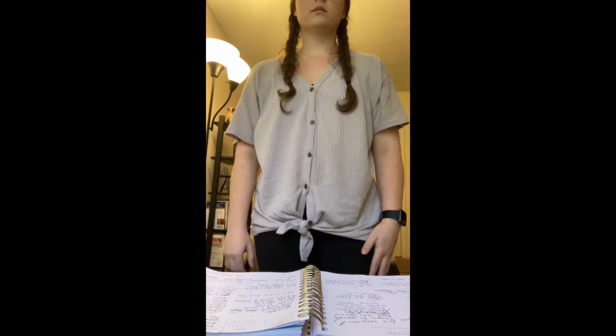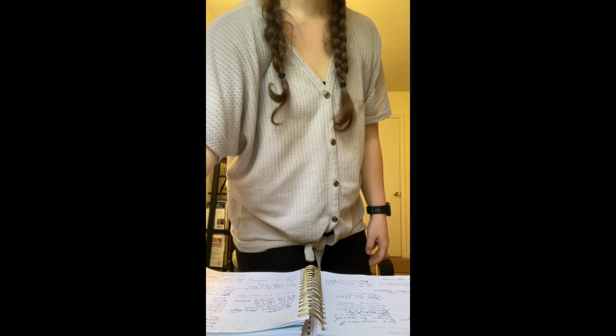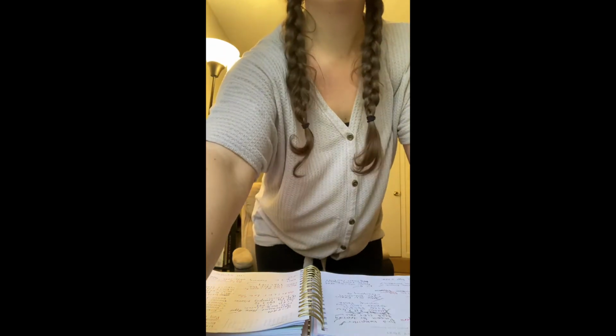For the baby arm or abduction view, the patient can still stay standing where they are, but they're going to raise their arm this time, and their hand, their palm, is facing forward. Central ray is still through the coracoid process, so you can see the shoulder joint and the AC joint for that view. And that's it for those chronic views.